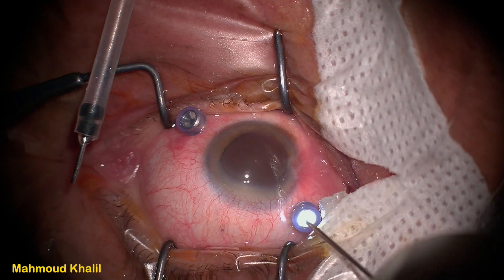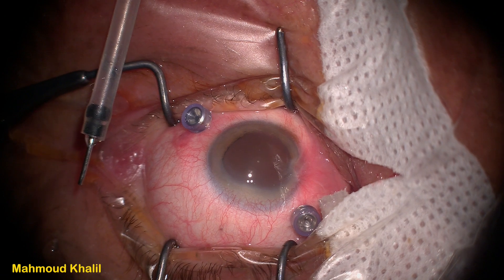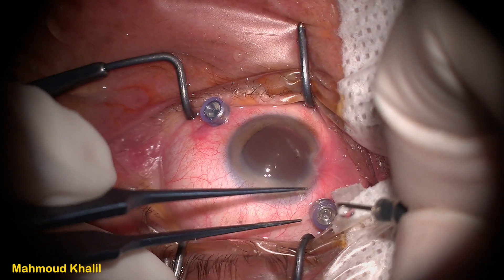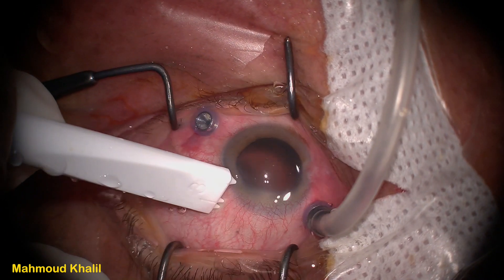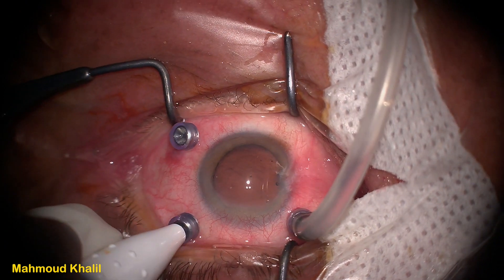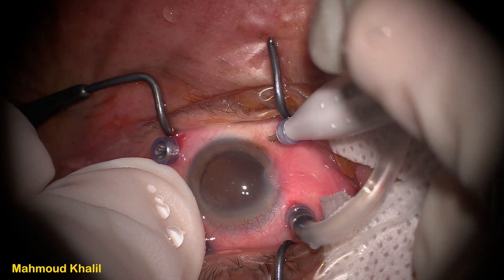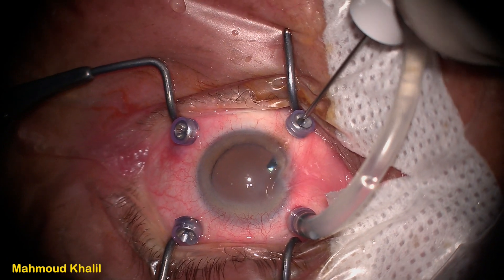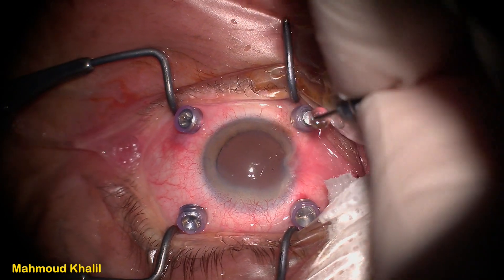After confirming the light probe position, I made another trocar incision to place the infusion cannula. But first I also checked the light probe inside the eye — it was freely mobile inside, confirming it was safe to place the infusion cannula inside this trocar temporarily. However, I cannot complete my operation from this side because I need this trocar for instrument movement and for using my chandelier light or endo-illuminator. So I was just maintaining globe pressure to prevent hypotony.